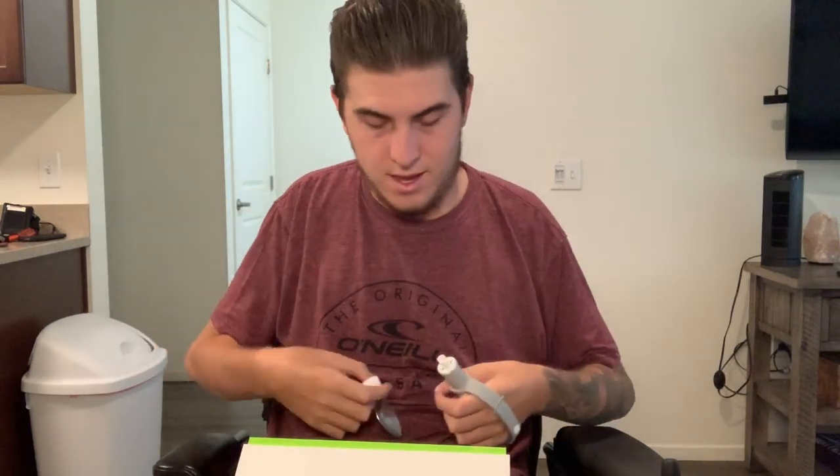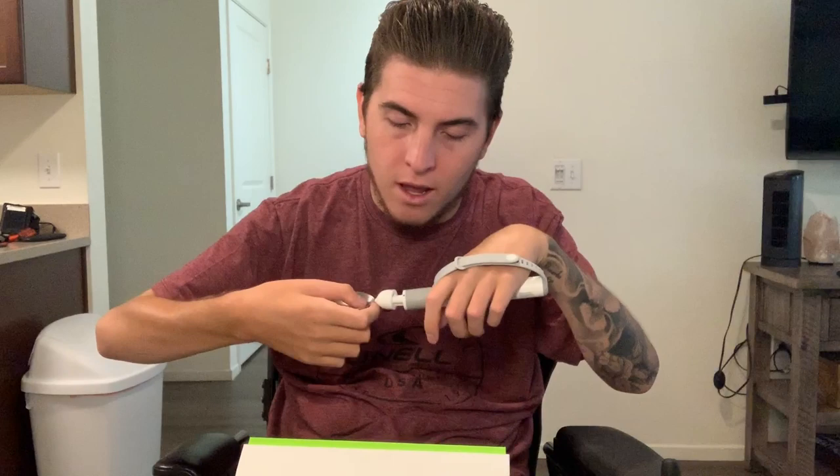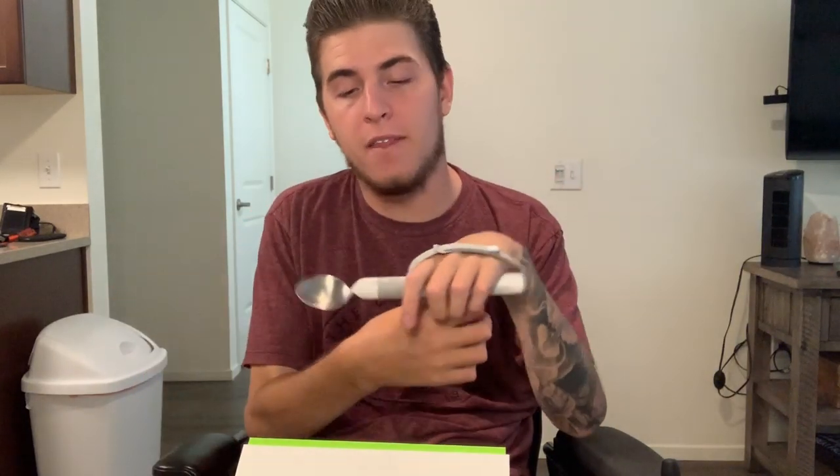And here is the spoon. I've already kind of tested this out just so I knew what I was doing. It connects right here — almost magnetizes — and then it makes a little sound. If you can see, when I turn it, it self-levels. Any direction I go, it'll kind of turn around. It just did like a 360. This thing is so cool.